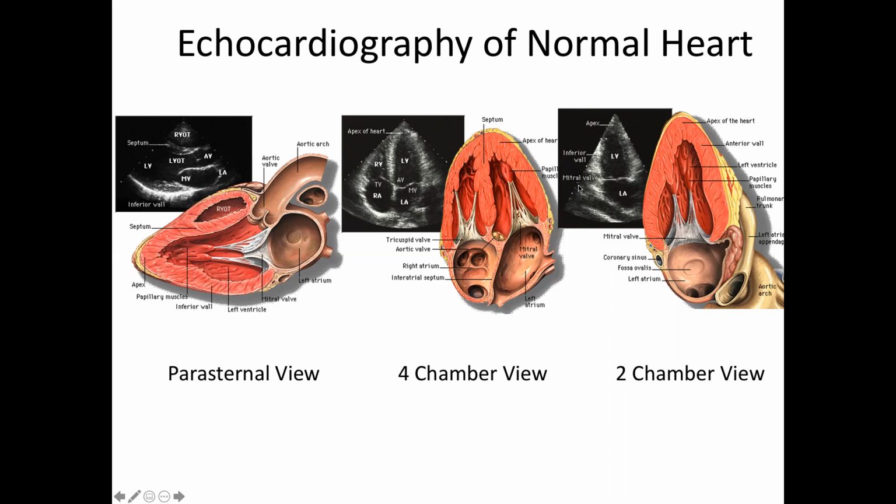Each one of these classic views you'll record, right? And then when the physician takes a look at this, they're usually not in the room when this is done. They're in the back room reading these cases. It comes across their workstation, and these movies are all loaded up, ready to go, and they just cycle through them and take a look. Normally, if the tech is good, they don't have to go back and say, oh, we missed something, we should have done this view, that view. The tech will adapt to the situation.